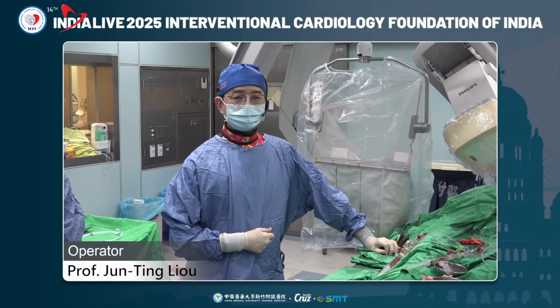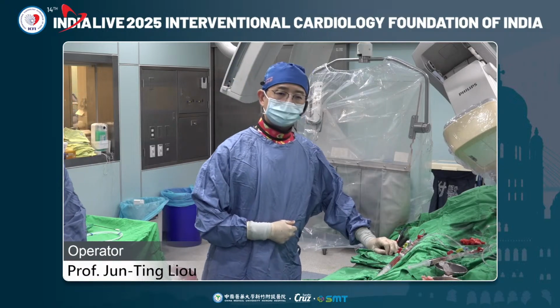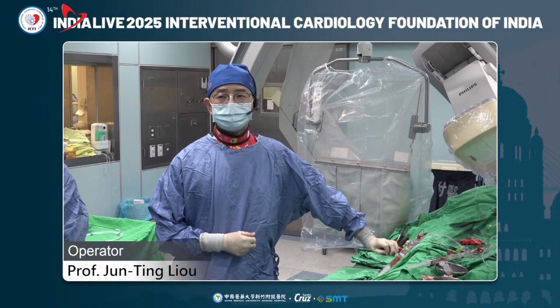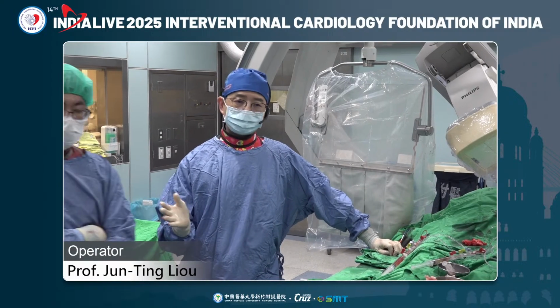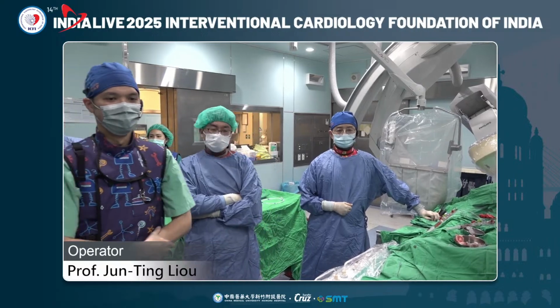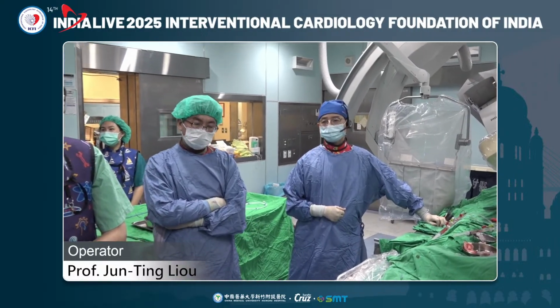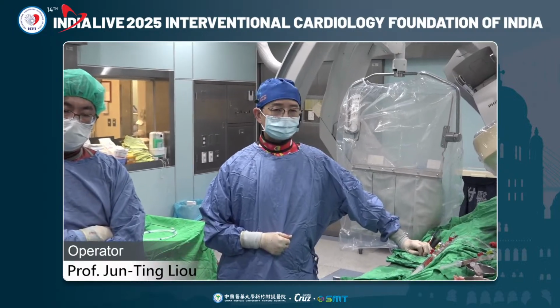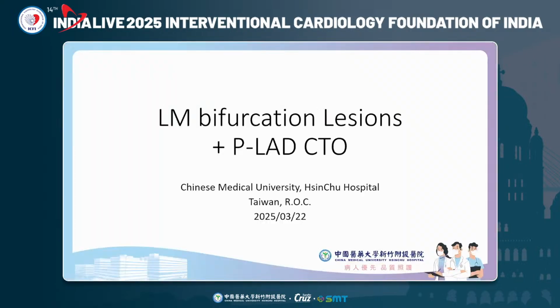I'm excited to present a case with a complex lesion today. Joining me in this cath lab are our esteemed colleagues, Dr. Yang and Dr. Xie, and an interpreter. Today we are looking forward to sharing our case in a live demonstration of this complex case. Can we show our case?